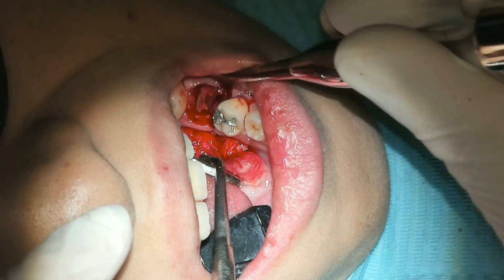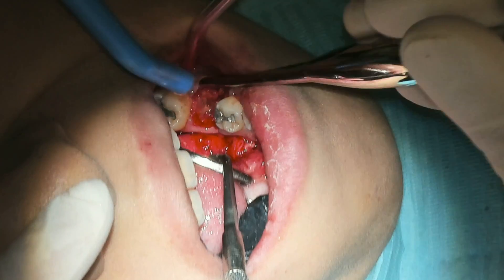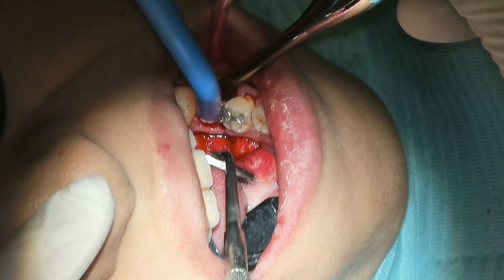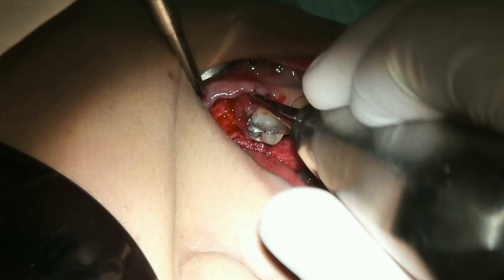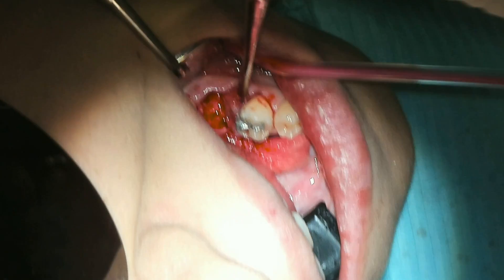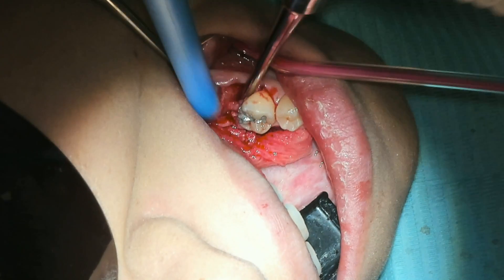After the distal root is completely out, we can make quick work of the mesial root. Then we grab the other east-west and elevate that right out.